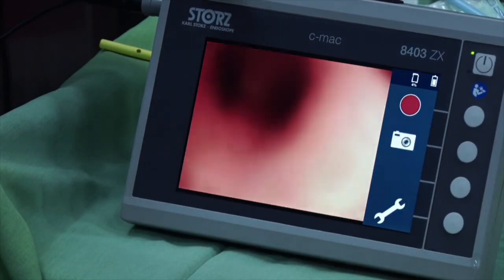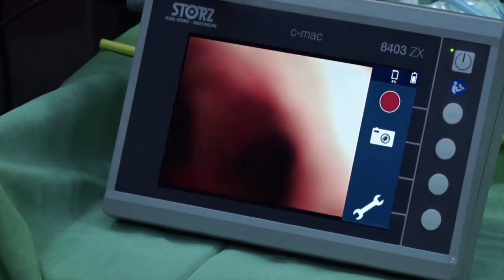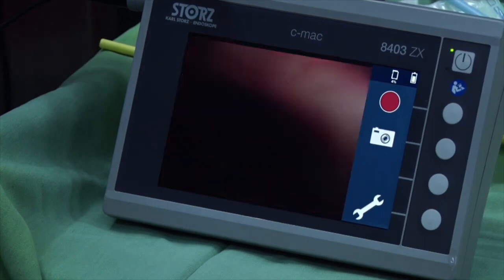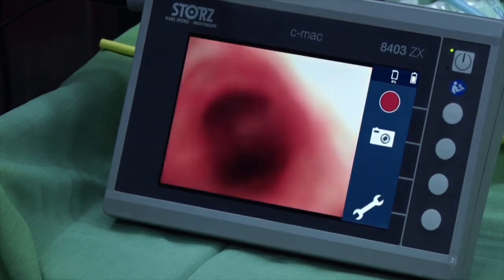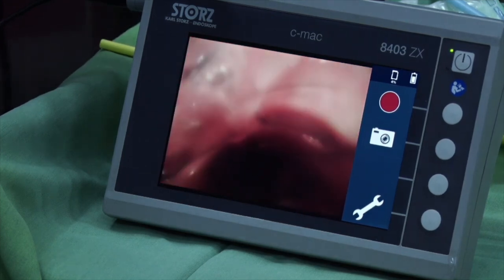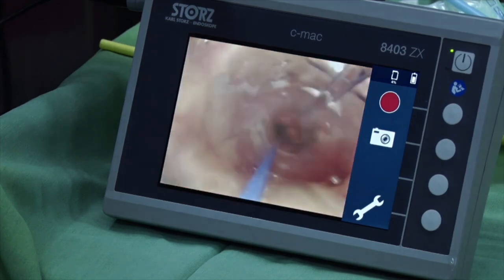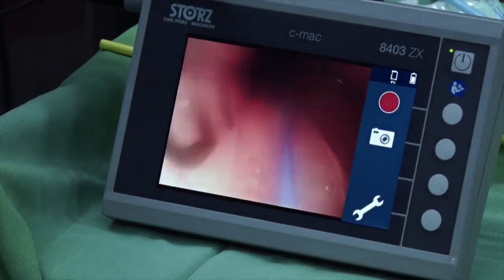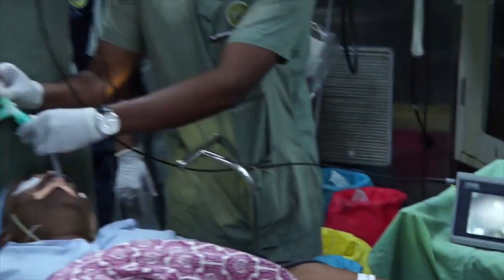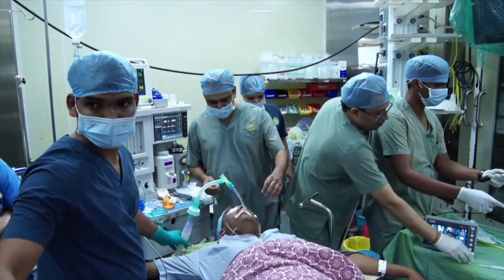This is the carina — I'm not going into any bronchus, but you can see the carina. Use your right hand and left hand to manipulate. The jelly on it lubricates the scope as well. We have confirmed the position of the ET tube — it's a couple of centimeters above the carina, which is exactly where you want it. That was an excellent demonstration, thank you very much.